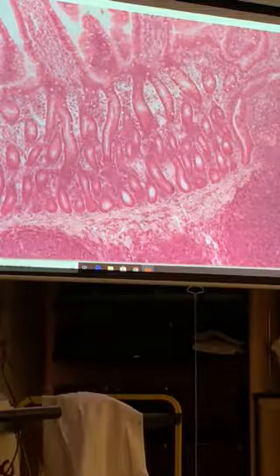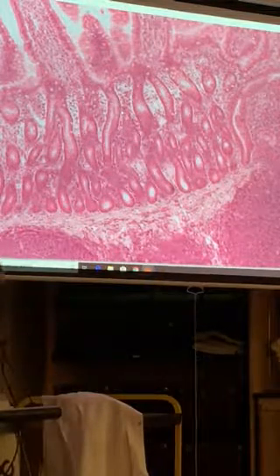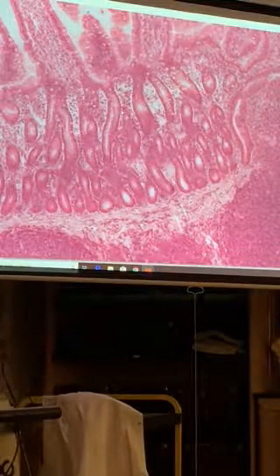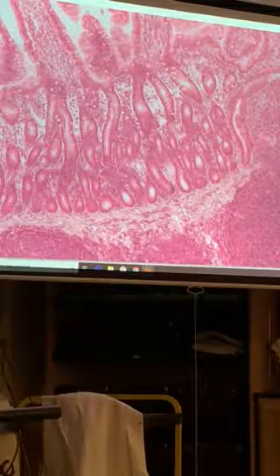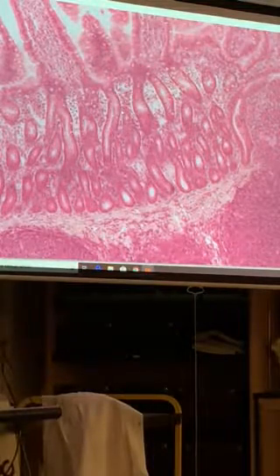They will have epithelial cells in them. They will have goblet cells. You just followed that villi all the way down and it did a U-turn. That's the intestinal crypts. What do they do? That's where you have the epithelial cell regeneration between the villi. So it starts at the bottom and they slough off at the top and it kind of moves up. We'll talk about it on Tuesday. Okay, switch.